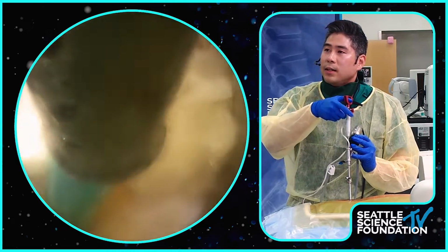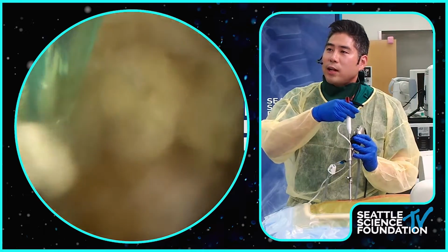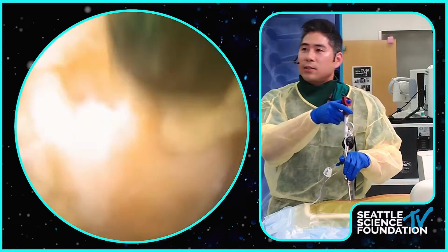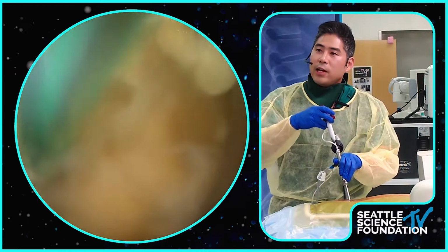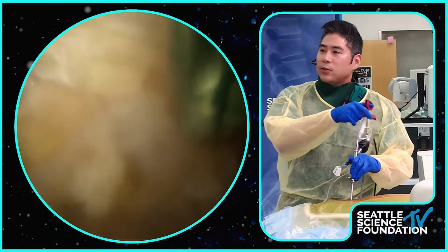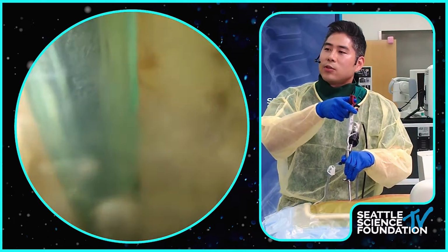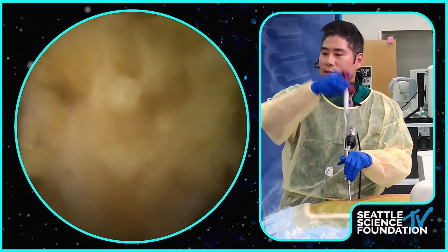Osama was doing this too. This is kind of like your finger. You can actually touch the tissue with your bipolar. And if I'm not on it, I can feel that this is the ligament. Okay? And so for orientation, this is the bone, this is the L5 lamina. Okay? And if I swing down, this is the S1 lamina. So I can feel what the anatomy is without actually sticking my fingers in. Okay.